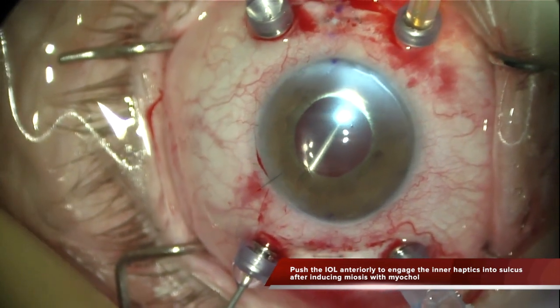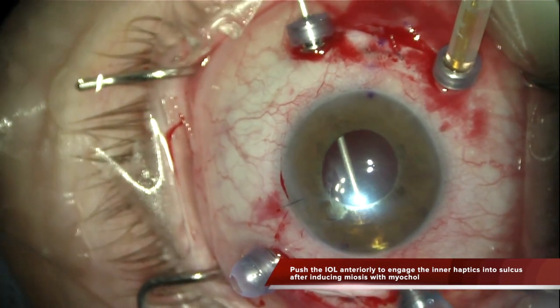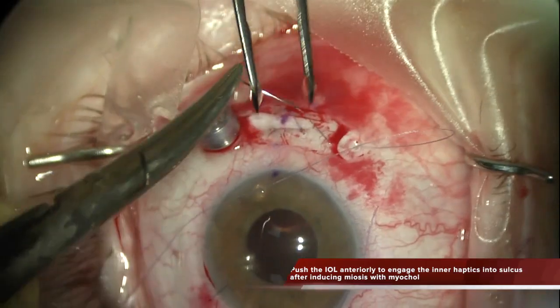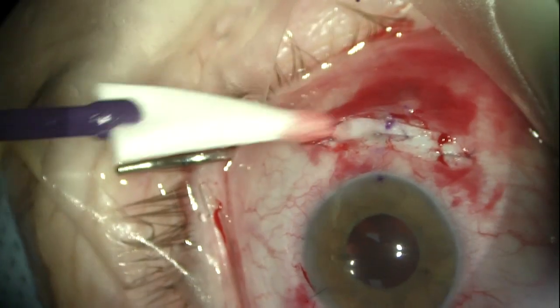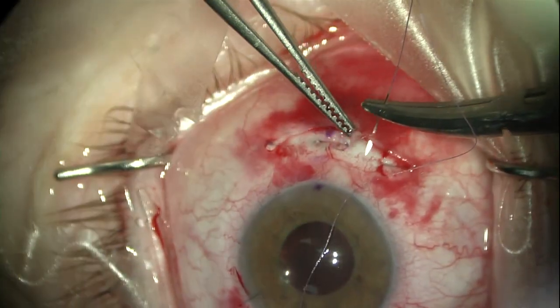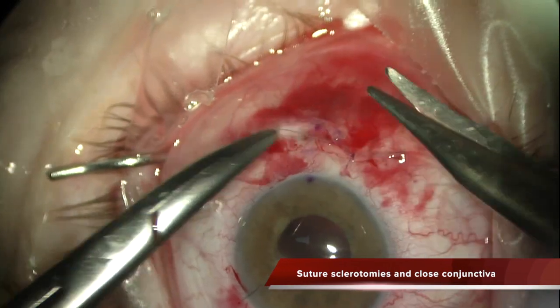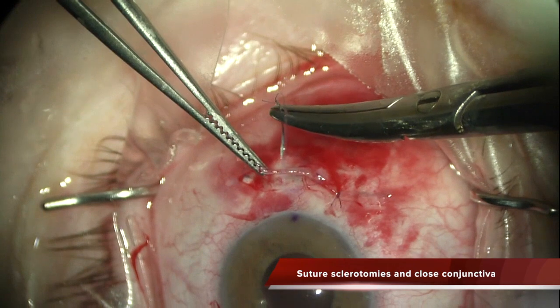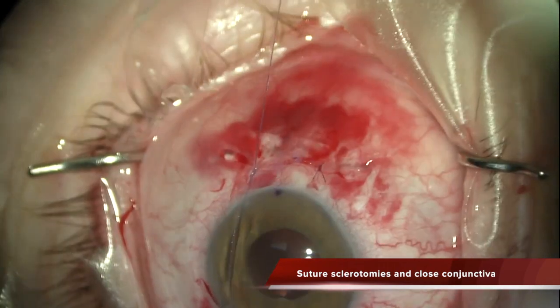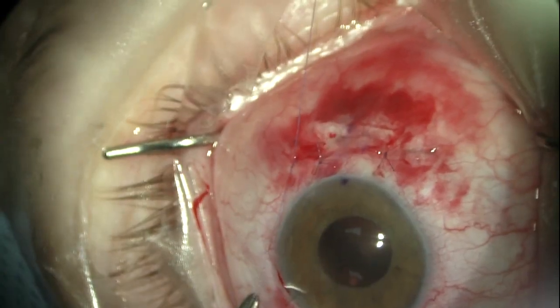So once the scleral pockets are sutured, I am pushing the IOL anteriorly to engage the inner haptics into the sulcus, and then I am removing the sclerotomies and the micro cannulas and suturing the sclerotomies as you can see. Once the sclerotomy is sutured, the only thing you have to do is close the conjunctiva gently with two or three stitches. As you can observe with this architecture, the conjunctival incision is closed at 2mm from the surgical limbus and the scleral tunnel is sutured 4mm from the surgical limbus, so it is completely covered by conjunctiva, avoiding any risk of infection or leaking.